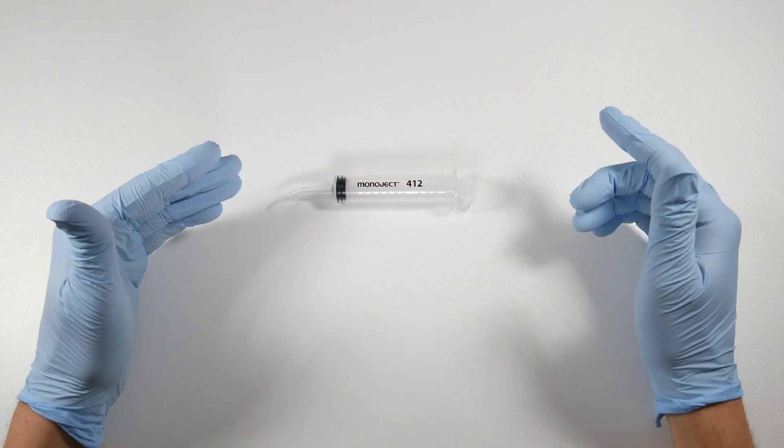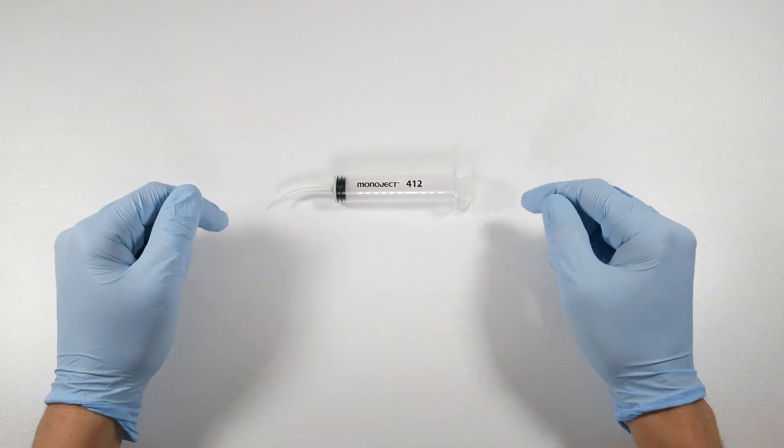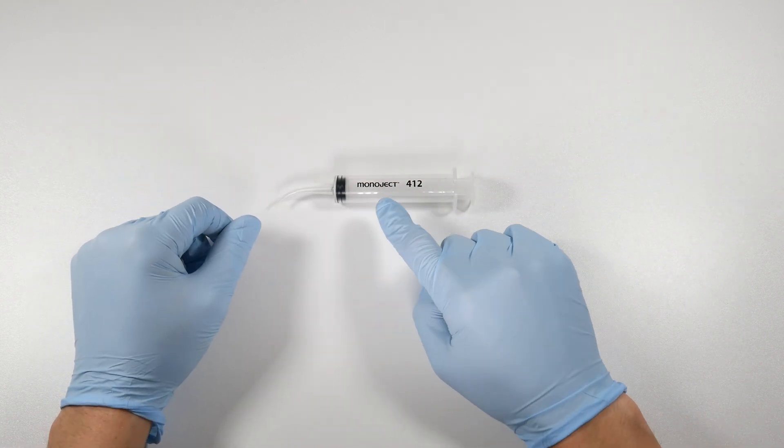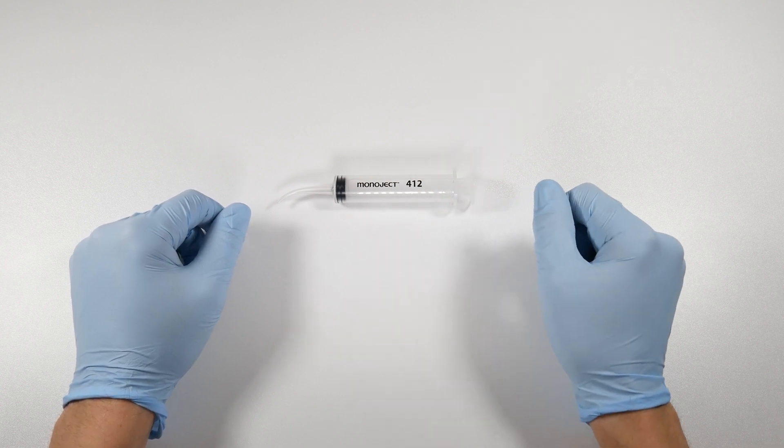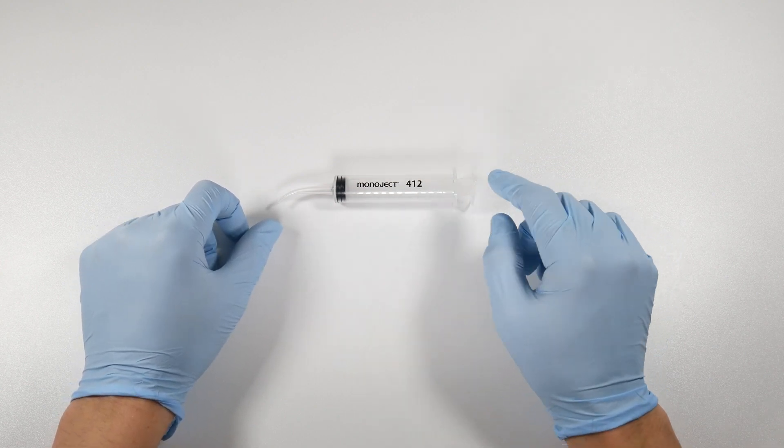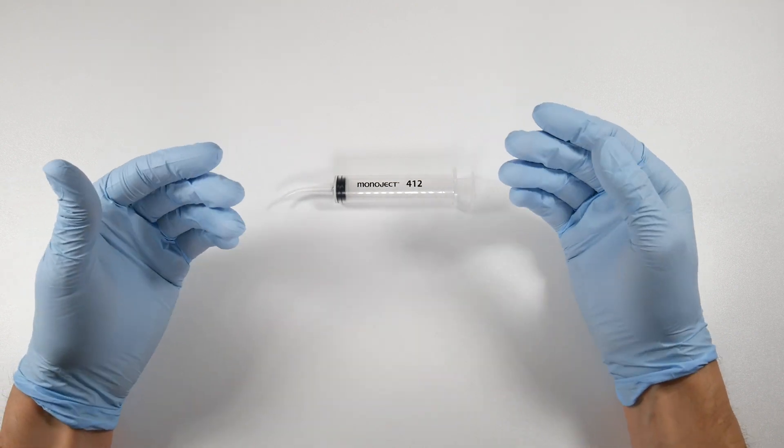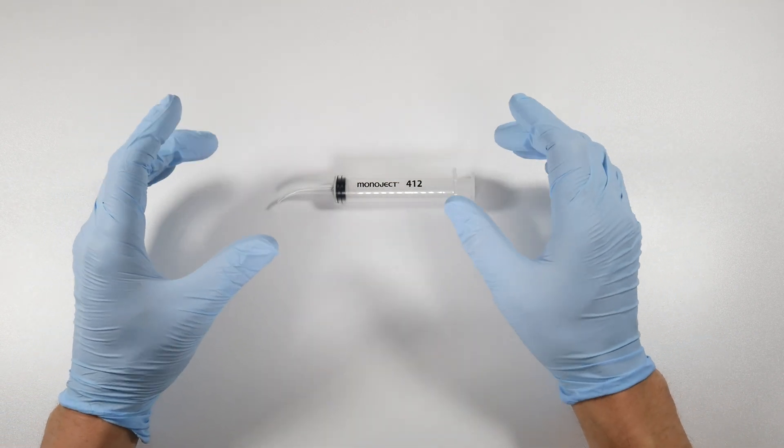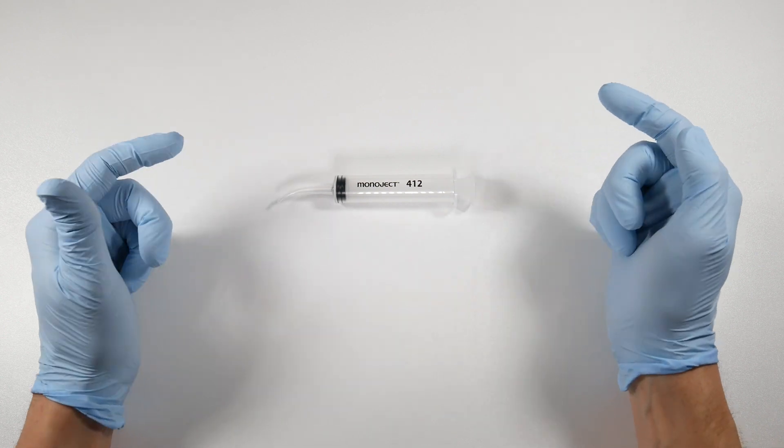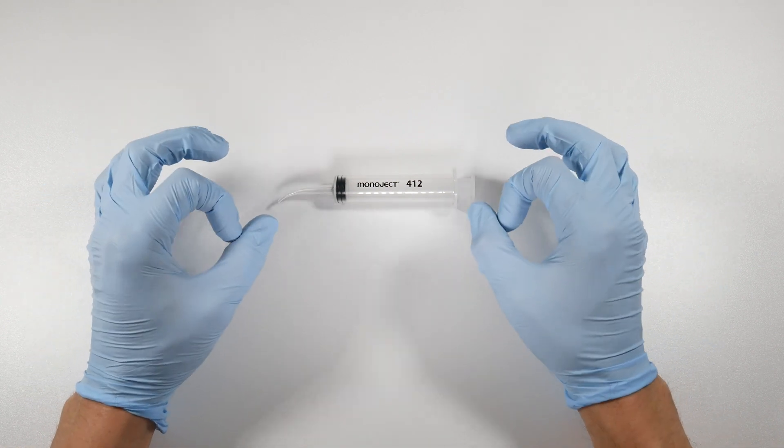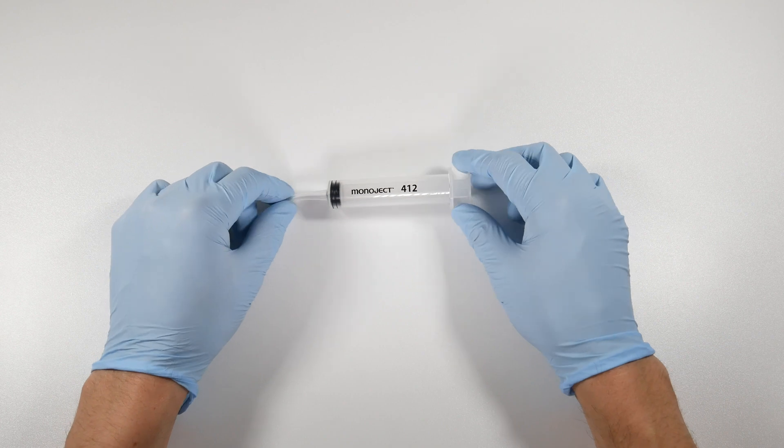So what happens if we do everything right and then our patient comes back to our office and they've developed a dry socket? Well, again, that's where you're going to be happy to have these monoject syringes around because you can fill them up with saline to then flush out that site and get some of the food debris and particles that may be sitting in that socket out of there, clean it up a bit, and then put your favorite dressing within that socket.